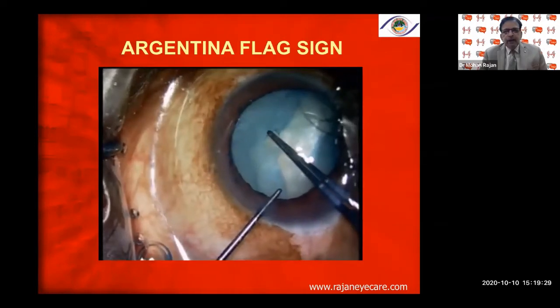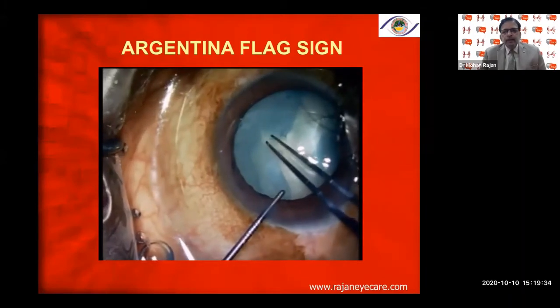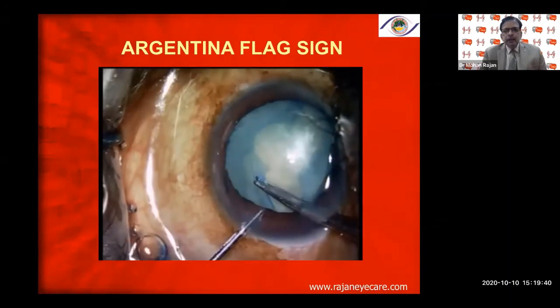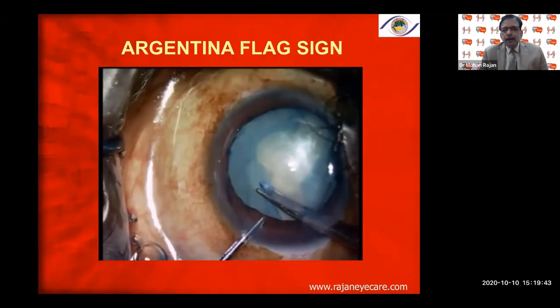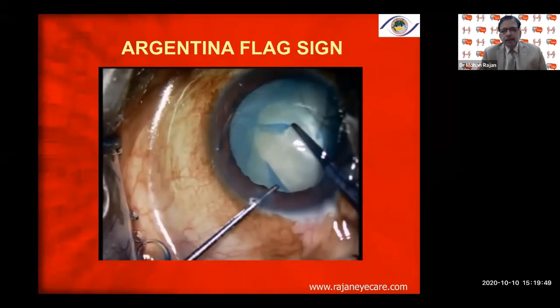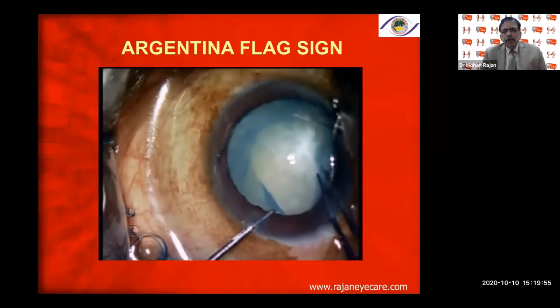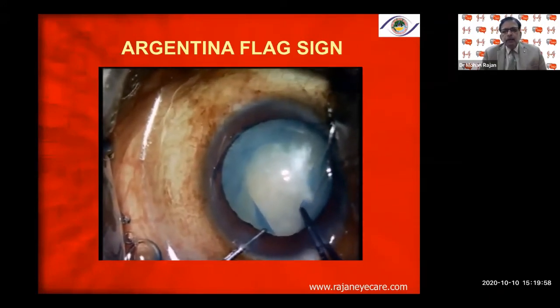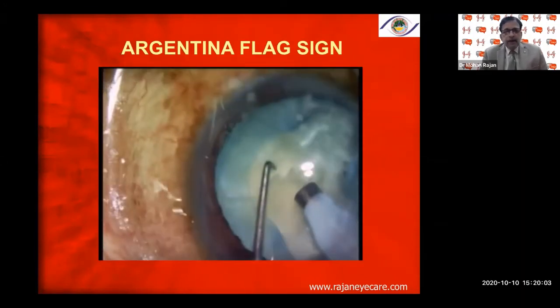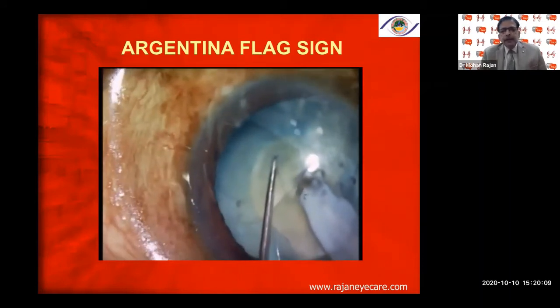In a fairly Grade 2 cataract, I complete the capsular rhexis by making a semi-circular rhexis on one side, making sure there are no flaps, then completing a semi-circular rhexis on the other side. So we have two semi-circular rhexis with two tears — one at six o'clock and another at twelve o'clock. The twelve o'clock tear is not very dangerous, but six o'clock is very dangerous.